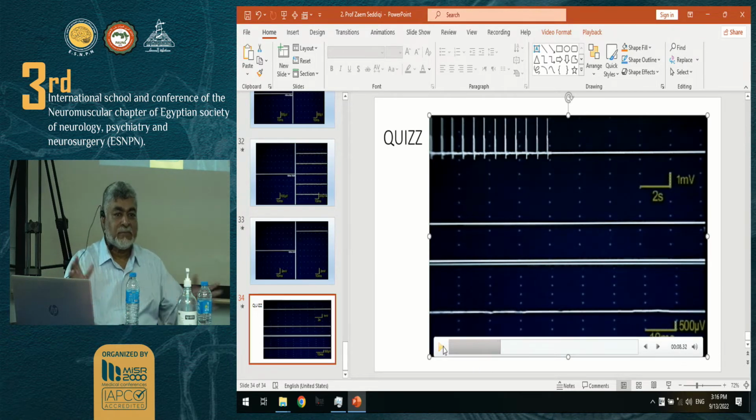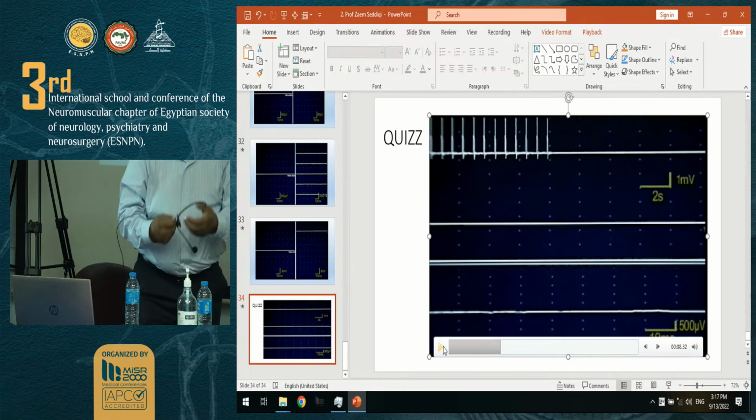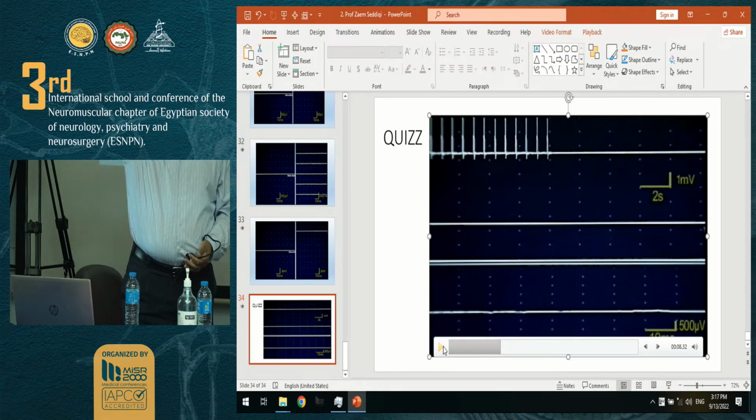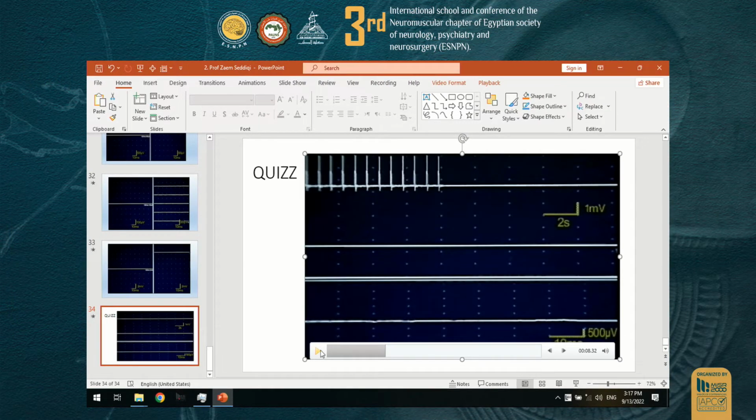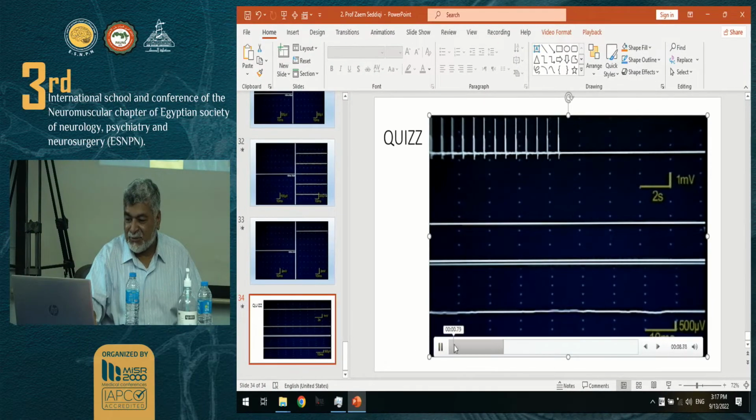What is that? Who thinks it's fibrillation? Raise your hand. Who thinks it's fasciculation? Raise your hand, guys. Come on, be brave. Nobody's testing you. How many think it's fasciculation? One more time. This is the last time. Guys.